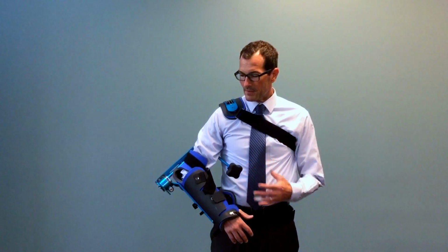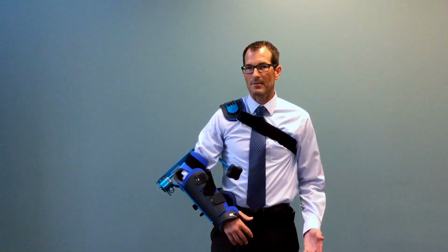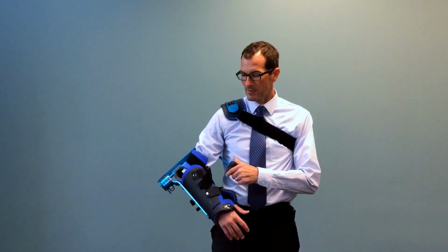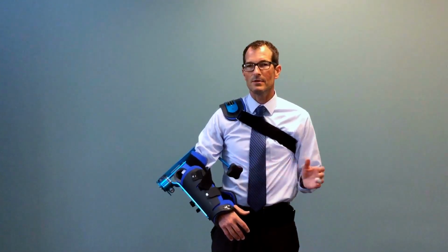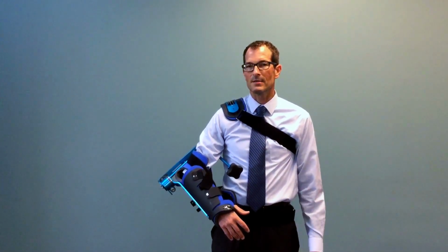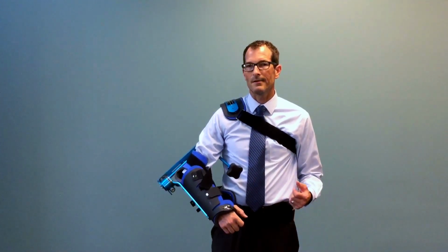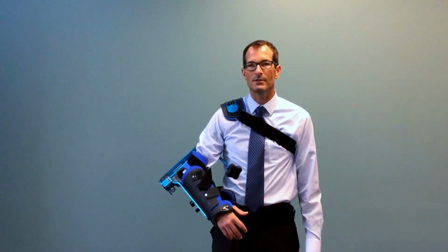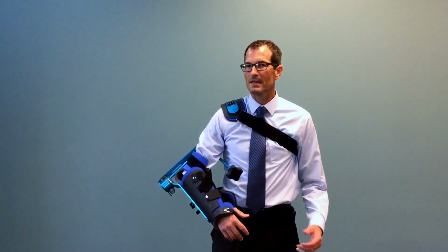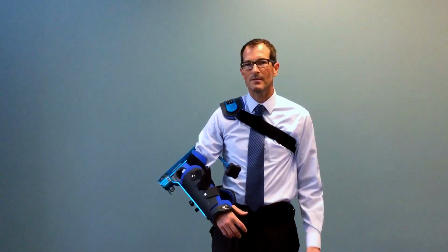Now, when we're looking at the shoulder device itself, what we're going to actually encourage the patient to do in regards to static progressive stretch is they're going to take this knob here and they're simply going to move their arm into external rotation, and we instruct them to actually stretch their soft tissue in their shoulder to a 3 on a 0 out of 10 subjective stretch scale. That 3 can be equated to reaching over to touch your toes, and you feel that uncomfortable sensation in your hamstrings. Not exactly pain, not exactly comfortable, a stretch sensation.